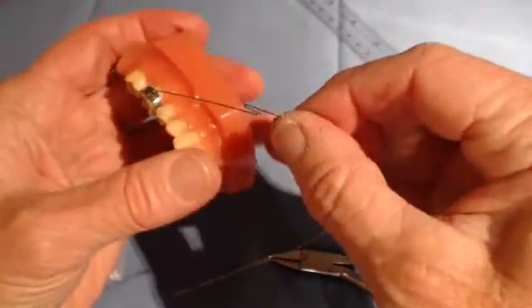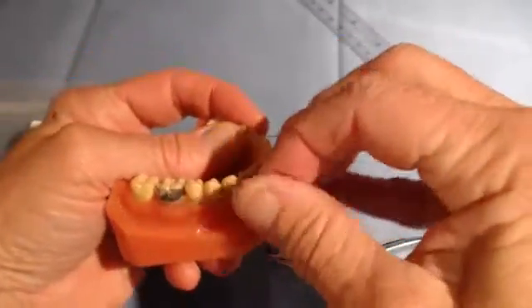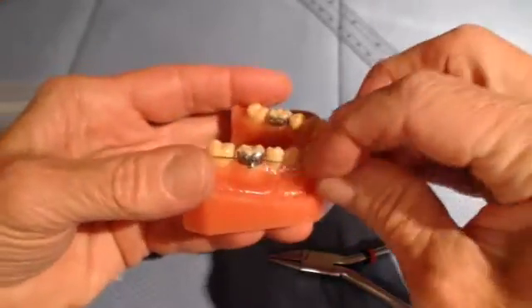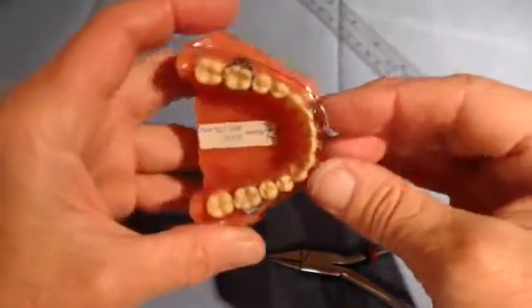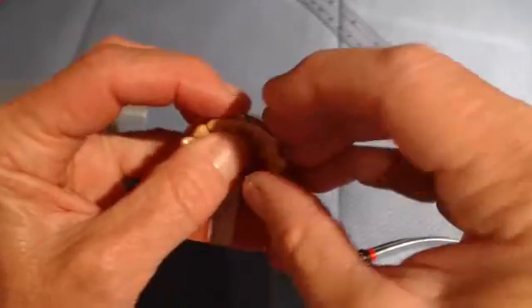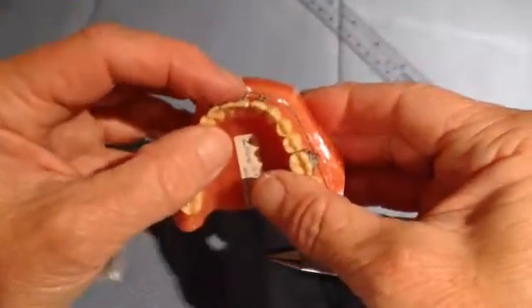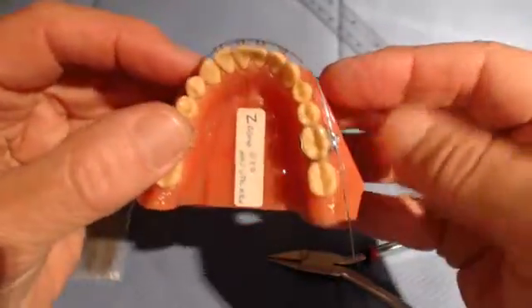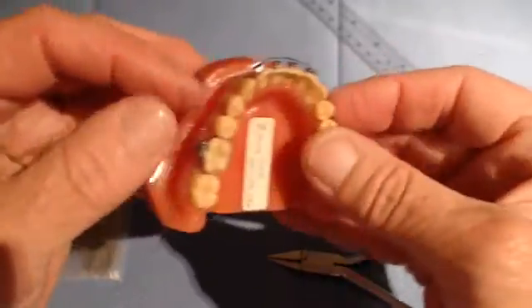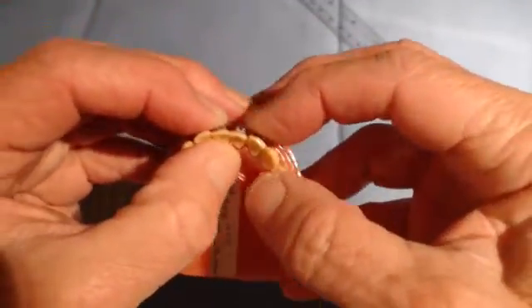Now let's reinsert the wire and see how we did. Put it back in the tube on each side. Of course you would cut this flush to the distal end of the molar because there's no reason for it to be long — there's no cinch back or anything on there. It goes under the hook, as you can see, and back in the molar tubes. And now you see a relatively passive Z-bend utility arch. This would be tied into the brackets like that.